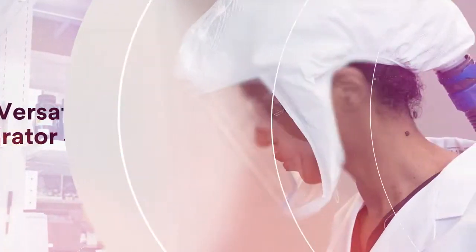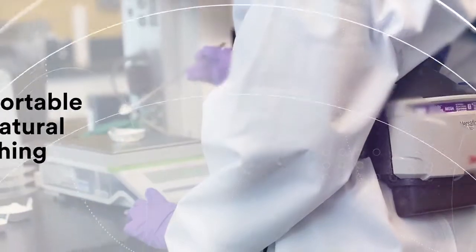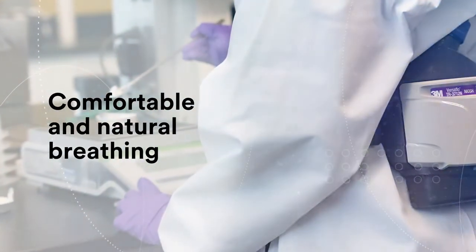The components of 3M's PAPRs are designed to fit and work together, so filtered air is delivered to the wearer via a motor and breathing tube.